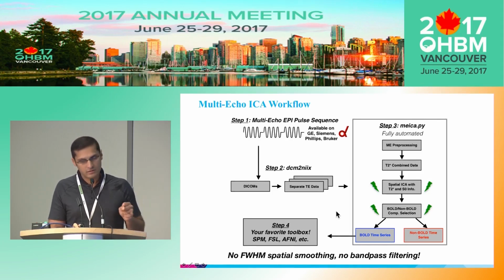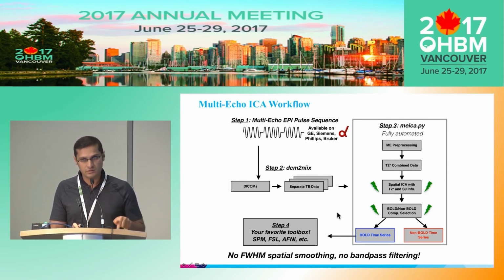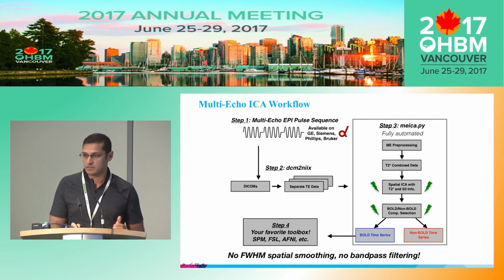Critically, I'm not going to go into detail here about why this decision was made, but no full width spatial smoothing is applied by default. And there's no bandpass applied by default because basically the super low frequency nuisance effects are non-BOLD, as are the high frequency effects. So they just come off in the denoising.